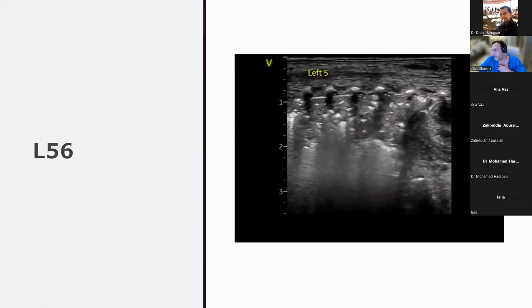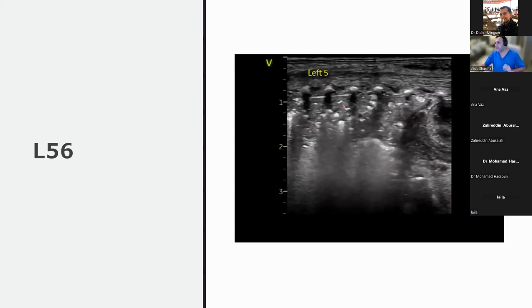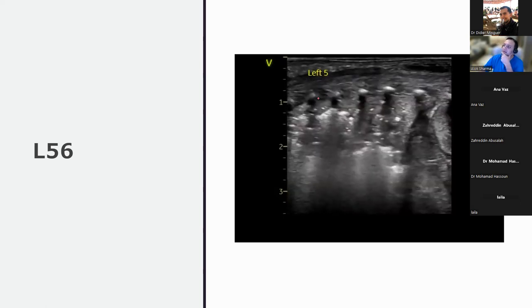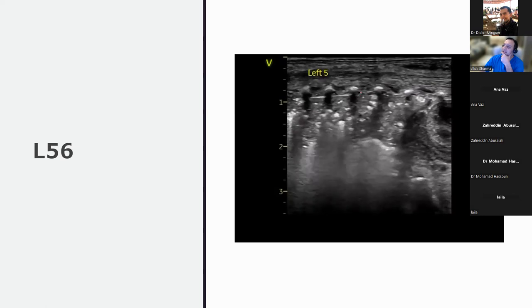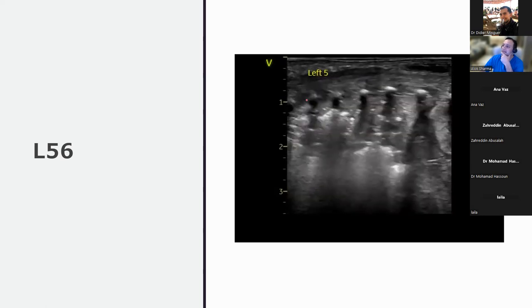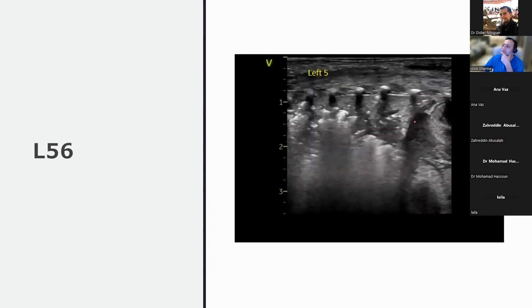And there might be some air trapping. So again, bigger picture, I don't have obvious dynamic air bronchograms. I have more static air bronchograms. And basically this margin here looks like a large area of atelectasis because the pleural margin is completely gone. I can't see pleura at all. I can just start seeing some pleura over here. Yeah. Maybe a little bit here, but it's completely gone over here.